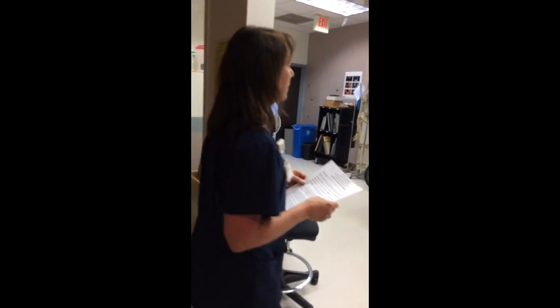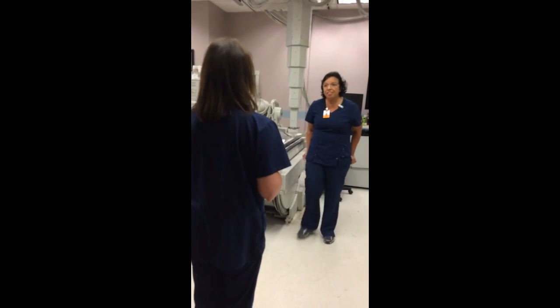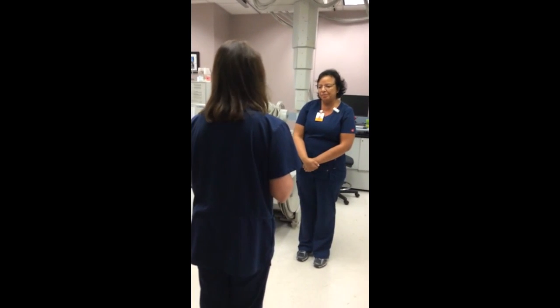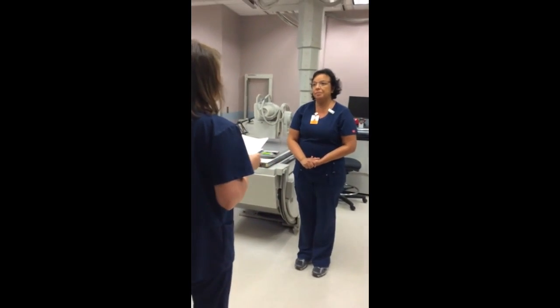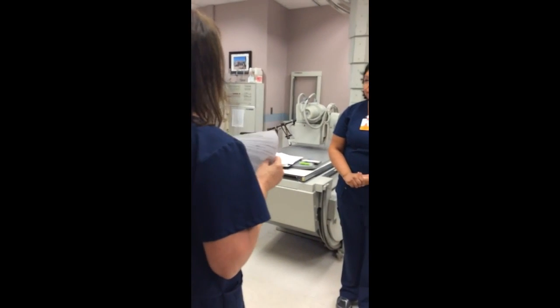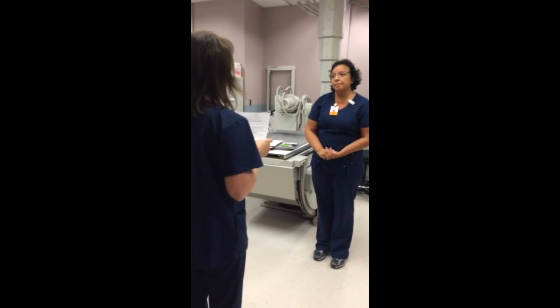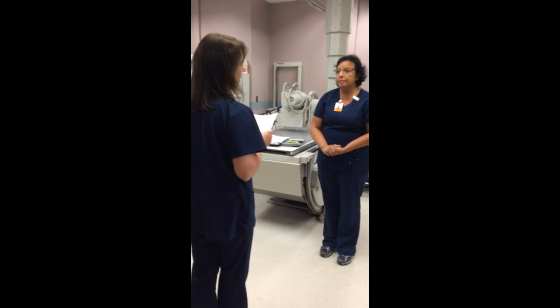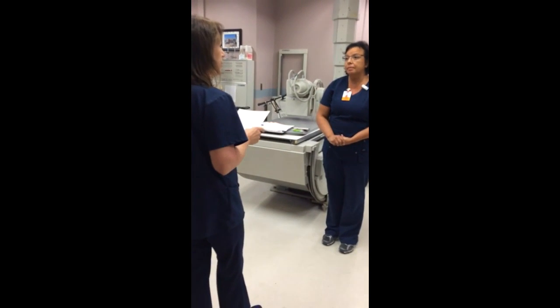Okay. All right, Mrs. DeWitt? Yes. Hi there. Hi. I'm Lisa from the radiology department. How are you today? Good, how are you? Good, thank you. Can you please tell me your first and last name again, please? Elena DeWitt. Okay. How about your date of birth? 2-25-75. Okay. Any chance you're pregnant today? No. Okay. So we're looking at some x-rays of your knee. Is it your left knee? Yes, my left knee. Okay. Have you had any surgeries?